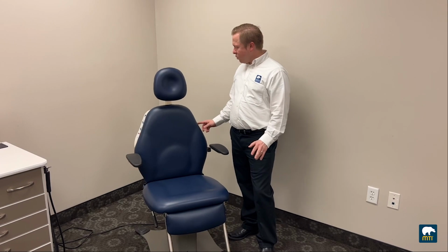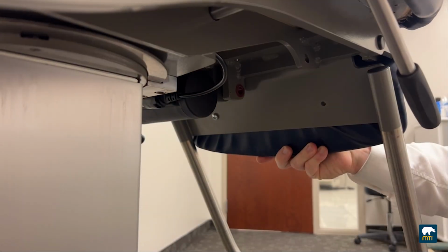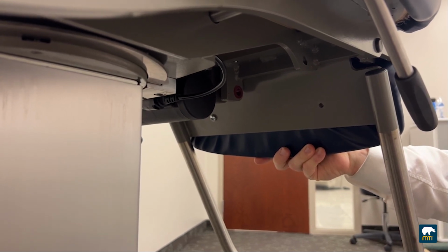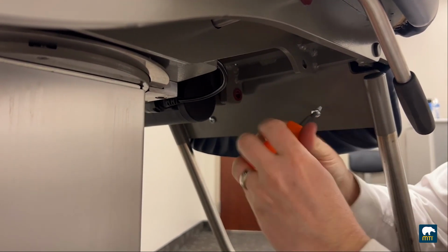If you purchase a 403 chair, it's easiest to raise the chair to be able to install the calf pad. To install the calf pad, line up the 2 holes in the chair with the 2 screw inserts. Fasten the screws using a Phillips head screwdriver.